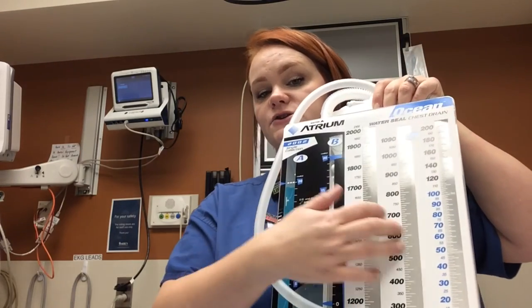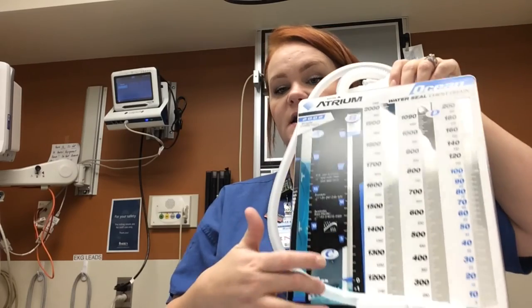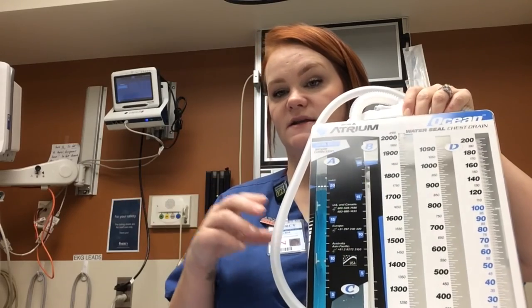Make sure that you're looking at your drainage, and you're looking to make sure that you have air bubbles or not in this chamber here. If you did not have air bubbles in this chamber, that means your device is not working and you need to reevaluate everything. For nursing, make sure that you're documenting your drain in Epic, that a chest tube was placed. If two were placed, make sure both are documented. Sometimes they will put one on the left and the right side of the chest.